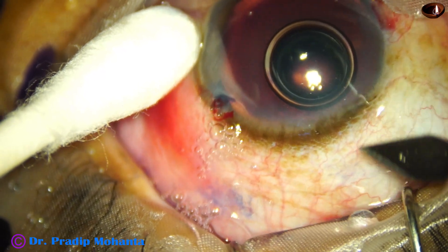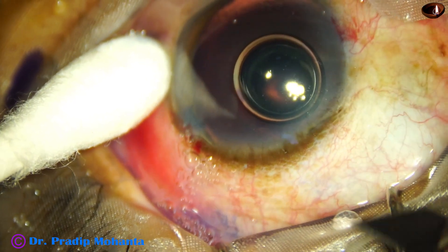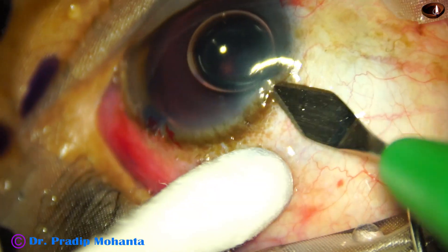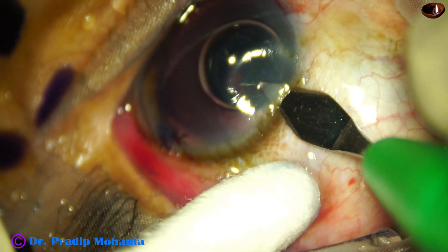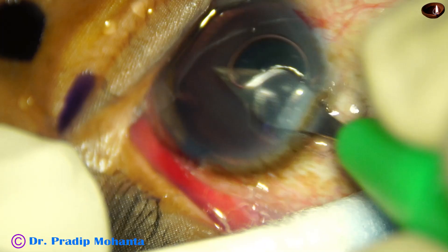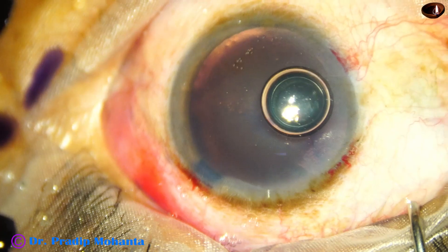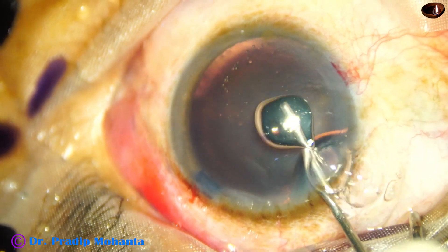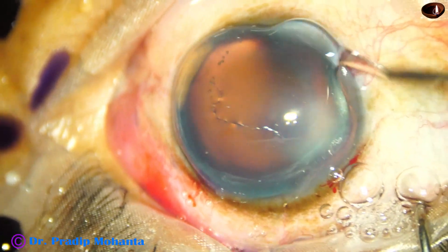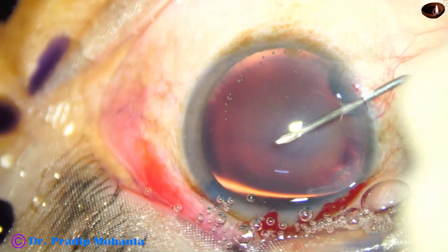Inject Visco and now make the side port first — make a groove, go to the floor of the groove, go through the cornea for a distance of about 2 to 2.5 millimeters, and then enter into the anterior chamber. Inject some more Visco so that the air bubble comes out. Methyl cellulose is applied over the cornea so that visibility improves.